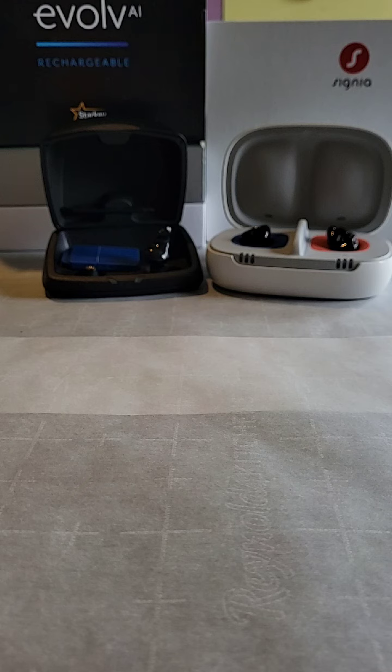What did I find out about the Signias I really didn't like? And this could be a setting problem, I don't know, but I did discuss it with my audiologist 5 days ago. When I'm in a quiet room with the Signia, I usually have a sound, which in a very quiet room is very disturbing because I'm trying to figure out, am I hearing the air conditioner, the fan? What is that noise? The audiologist came back that it's just a sign that these things are working. And really, I think it's the processor and the compression creating that sound.